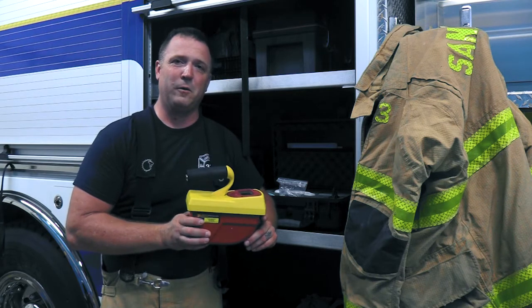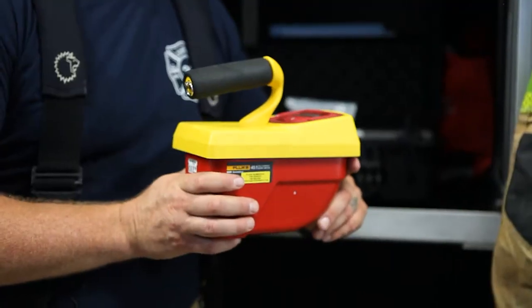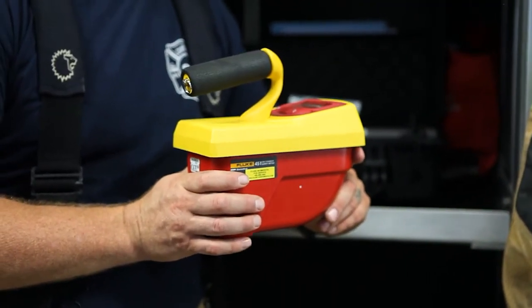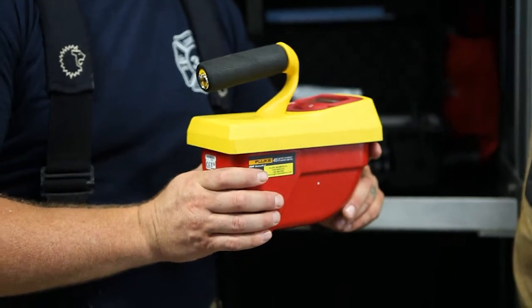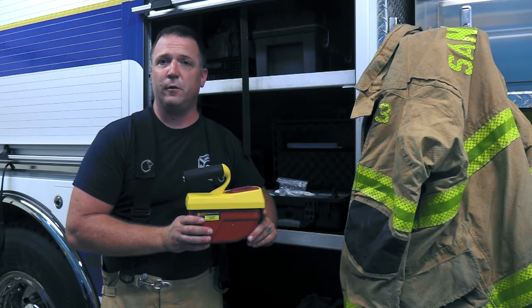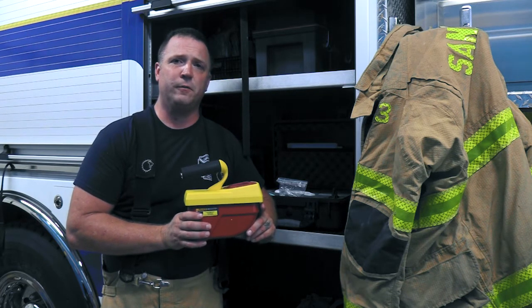Today I'm holding one of our older devices, the Fluke Biomedical or Victoreen 451P survey meter. You might recognize this from emergency management systems, as we utilize this device to detect for radiation leaks or contaminated areas. The 451P measures in both dose and dose rate, and there are some things about the 451P that aren't so conducive to us.